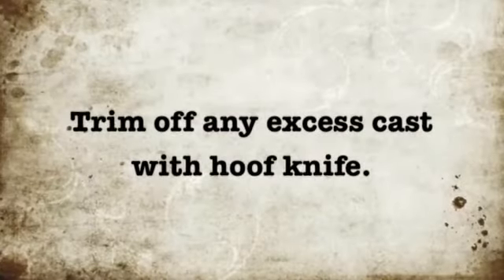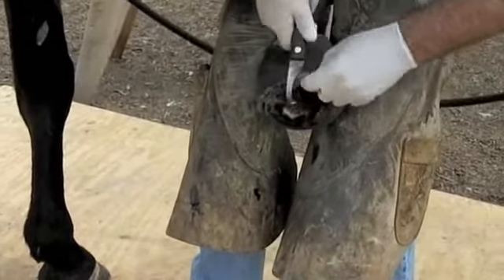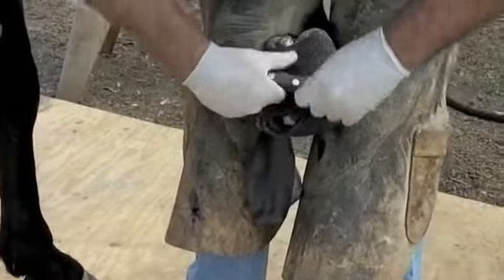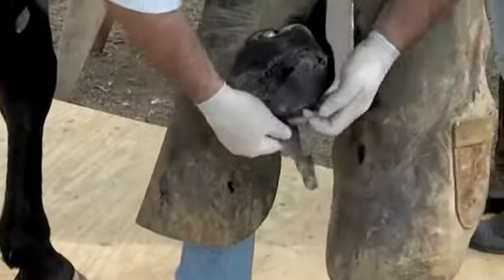Trim off any excess cast with a hoof knife. In this case, we had to go to a bigger cast because of the excessive frog to give proper frog support. Once you get done, you can trim off the cast, but be careful that you don't pull the cast off. I prefer cutting it from the toe to the heel, like I show in this video.